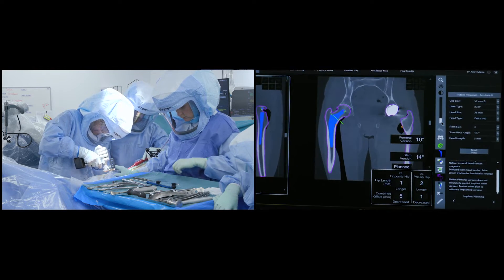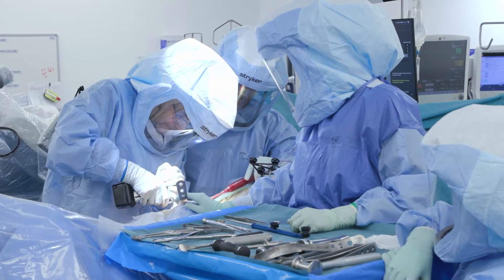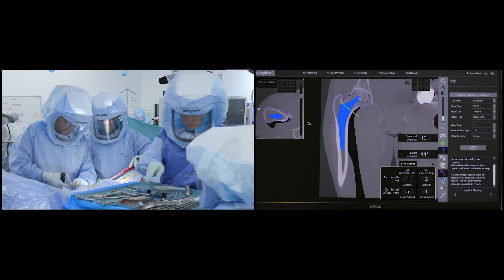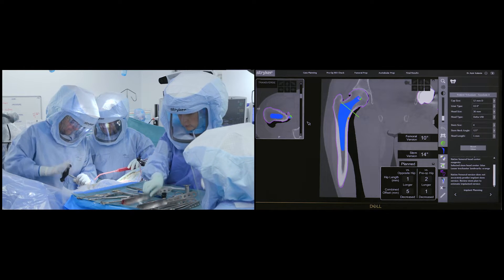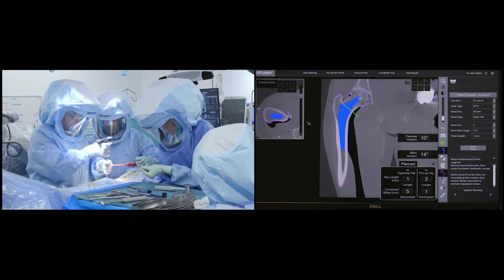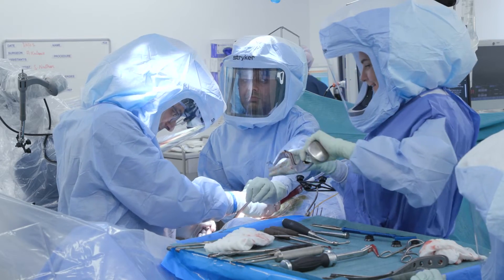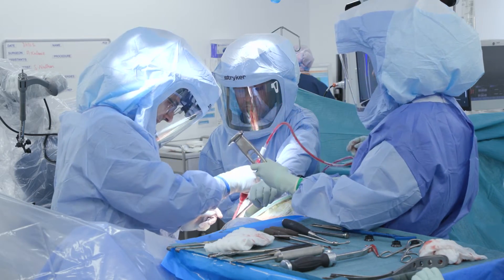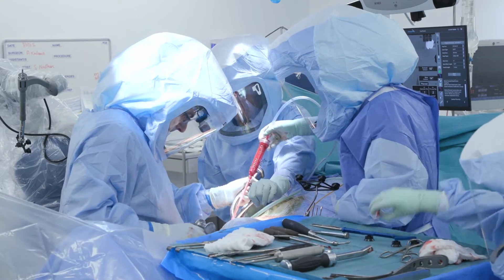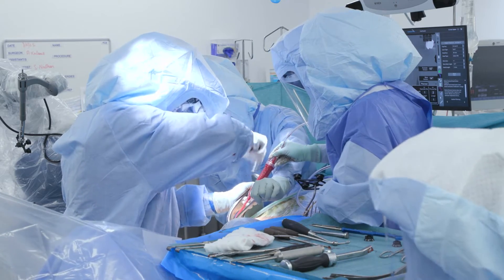Using the preoperative software to determine the level of the neck cut, I proceed with cutting the femoral neck and removing the femoral head. A special T-handled corkscrew is driven into the femoral head, which is then levered out of the joint. The head is either sent away to be used as donor tissue or discarded. Once excised, the femoral canal is prepared using special broaches that progressively expand it until a firm and stable fit of the prosthesis is achieved.